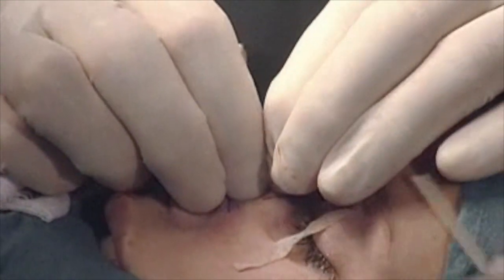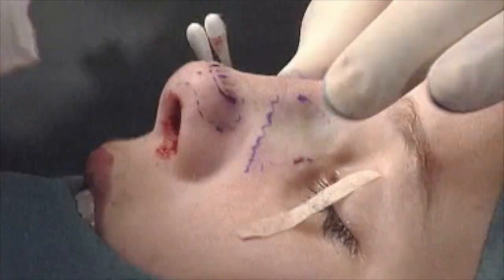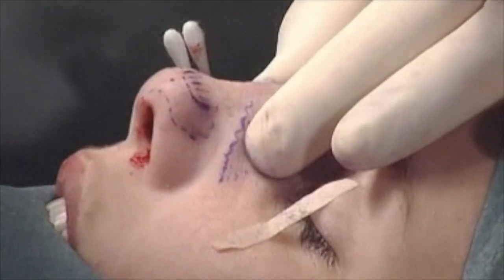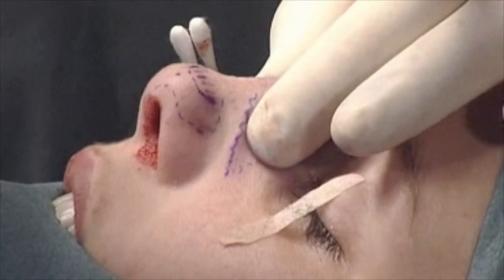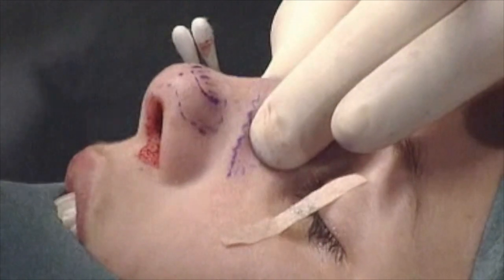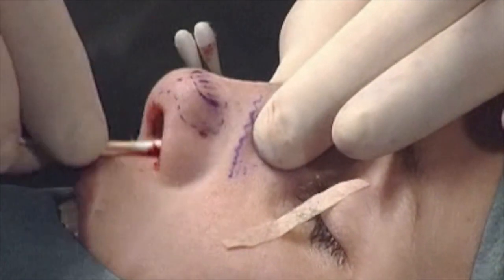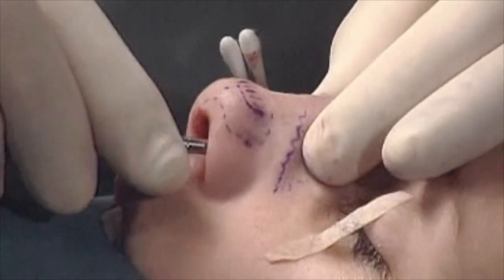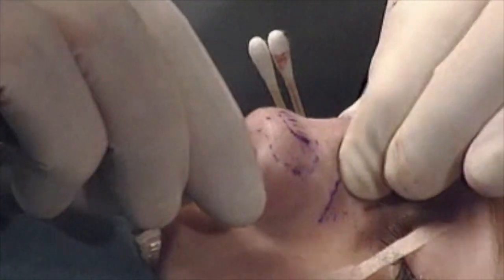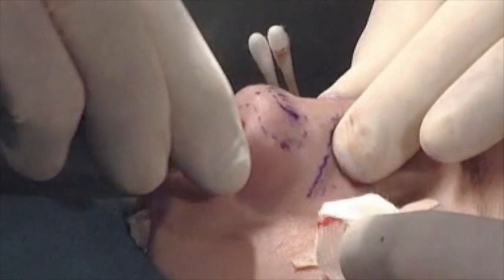Then we see there is some infraction. It's important that we are sure that the bones are very well mobilized, because otherwise there is a chance that post-operative it goes back in a lateral direction. That's not what we want. Okay, it's quite well mobilized.